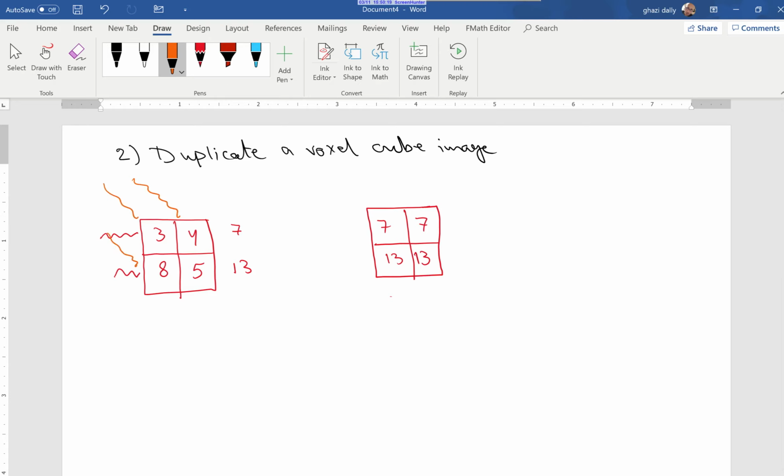because you know we are rotating the gantry with the patient at the middle, and we are hitting him by X-ray from different directions. Here we get diagonally 4, 3 and 5, 8 and 8.